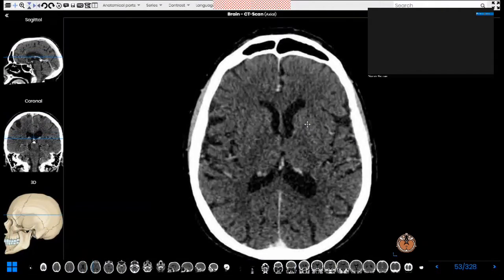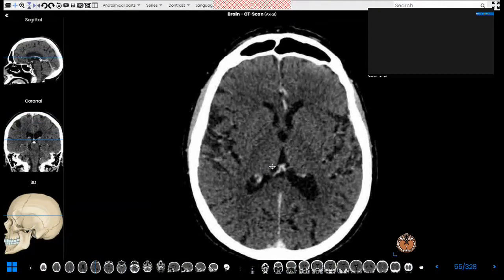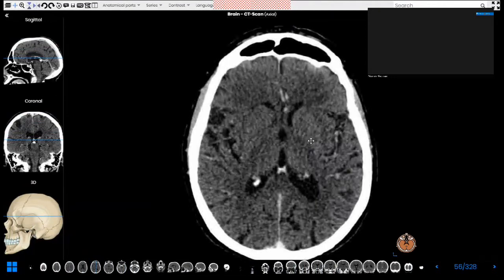This is the thalamus on both sides, this is the globus pallidus, and this is the putamen here. Together, we call these the basal ganglia — the basal ganglia being the caudate, putamen, and globus pallidus.